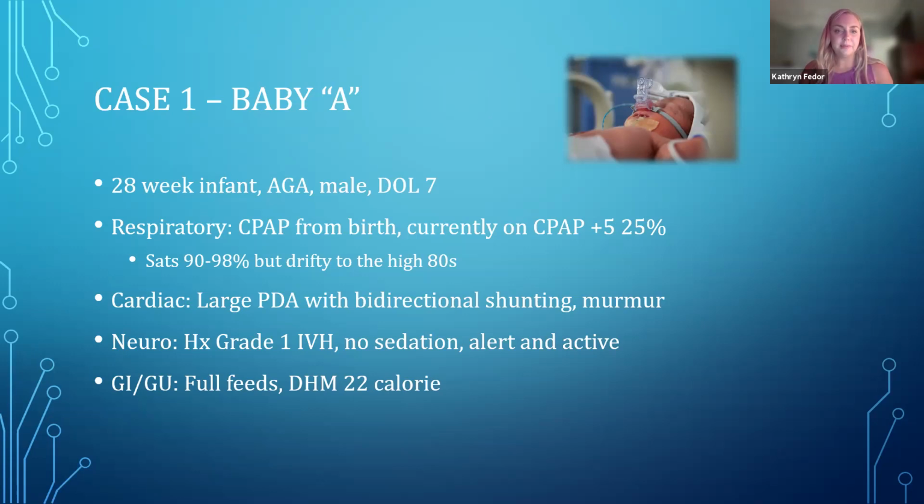So I'll bring up case 1, baby A. This case involves a baby that we had in our unit just prior to beginning the NIRS during transfusions project. And like I said previously, we had only had NIRS monitors on babies that were participating in our cooling registry. So this was really the first time we were going to put NIRS on a smaller baby in our unit.